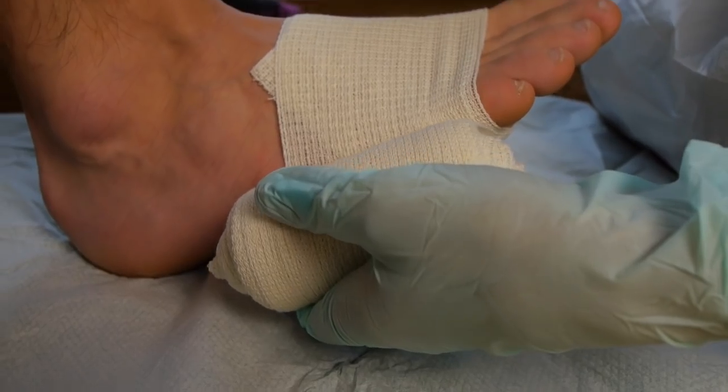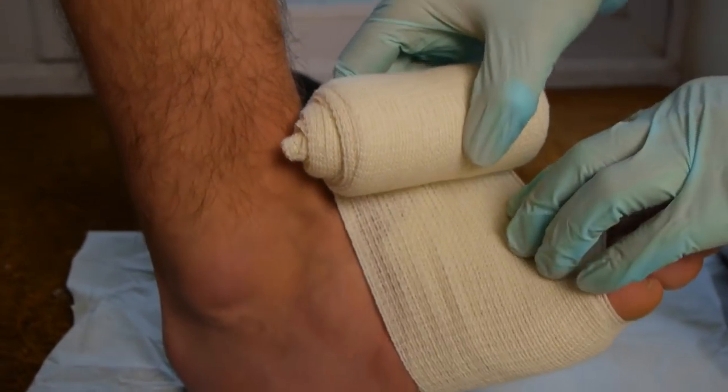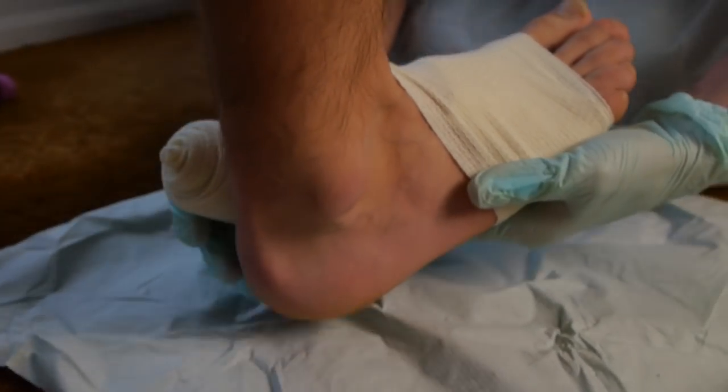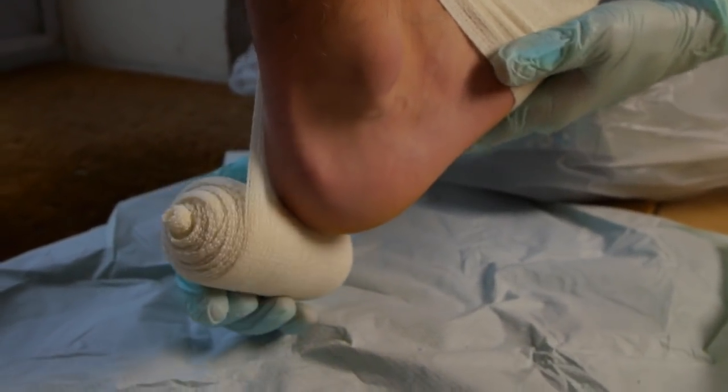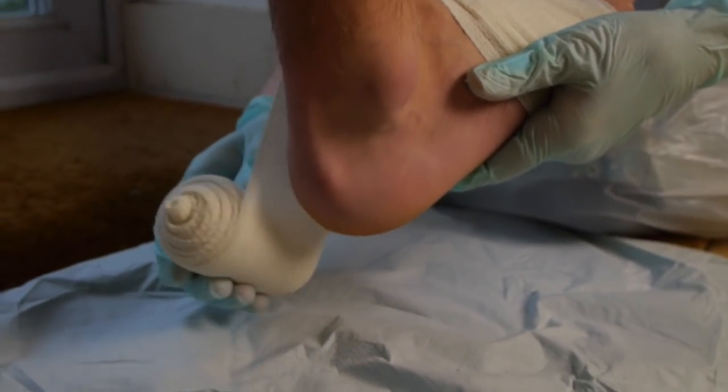When bringing it up the second time, you then want to unravel the bandage directly across the foot and then raise your foot over the heel, about a third of the bandage under the heel and two thirds above.